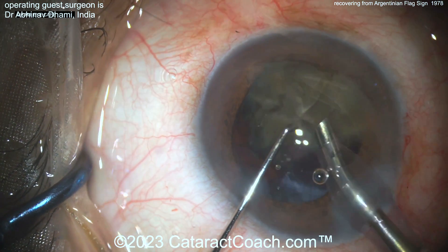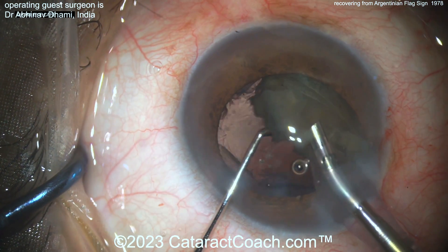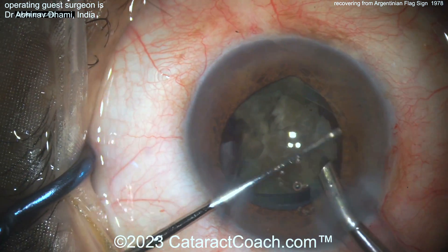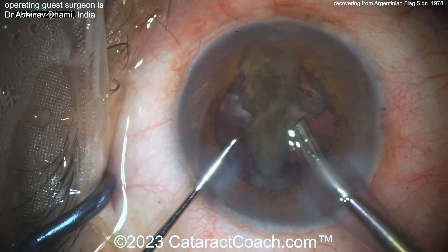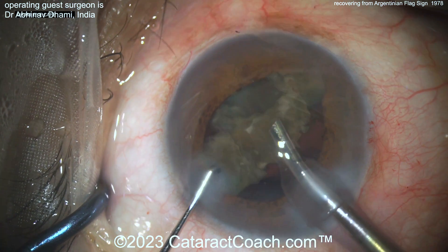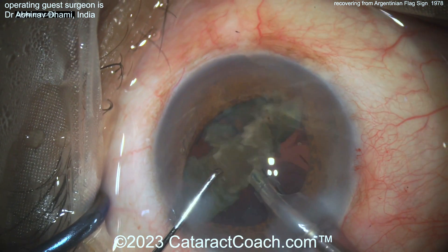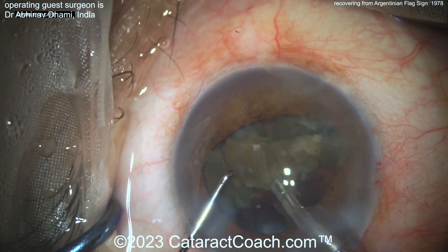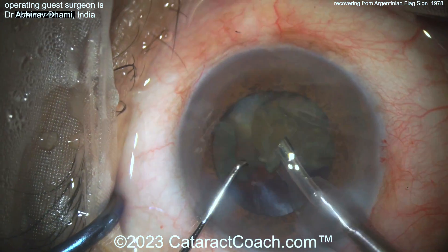But it could still be intact — you could have an intact capsular bag. I'm watching the video for the first time with you, and there looks like a real bright red reflex. Taking these pieces down — just wolf them down. I wouldn't chop it too much; if the bag's open, you don't want four, five, or six pieces of nucleus floating around everywhere. Better to keep it together as one big piece.